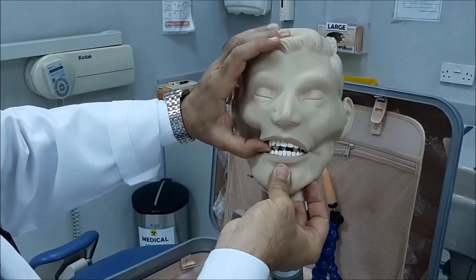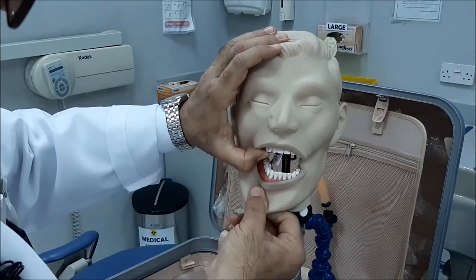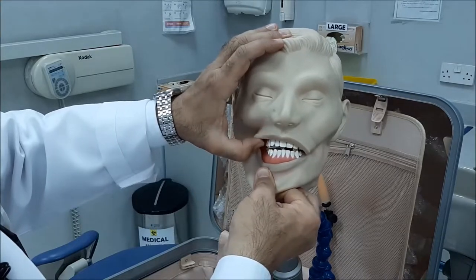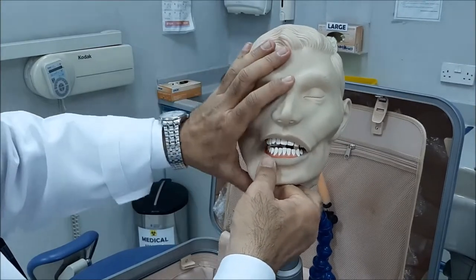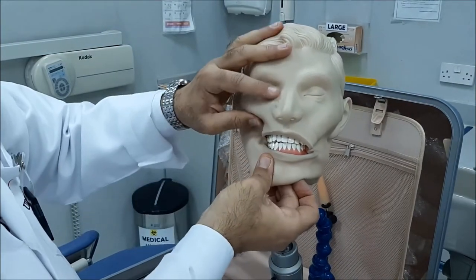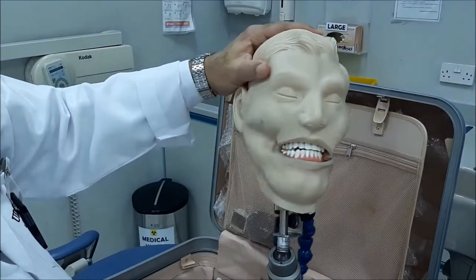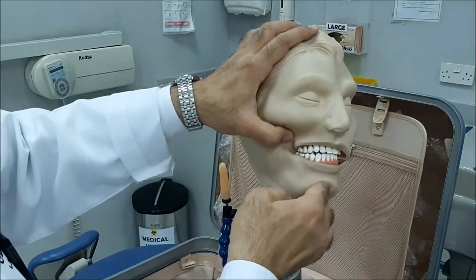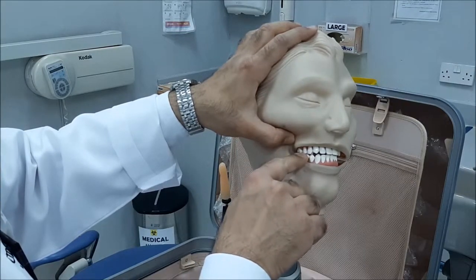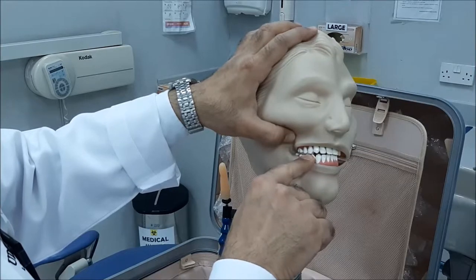And then you ask the patient again — there is no interference. Once it's all the way up, then you ask the patient to bite on the bite-wing tab, and this is how it will finally appear. What you show of the film is only this small tab. The two premolars are biting on the tab.